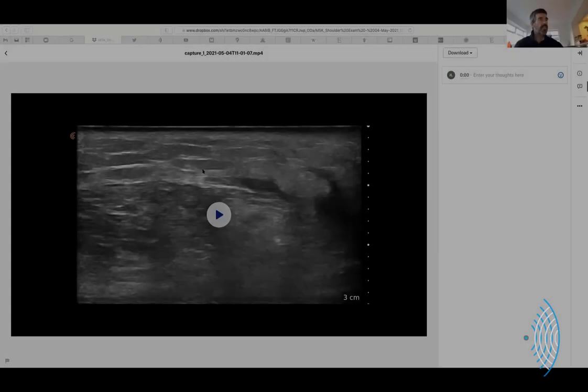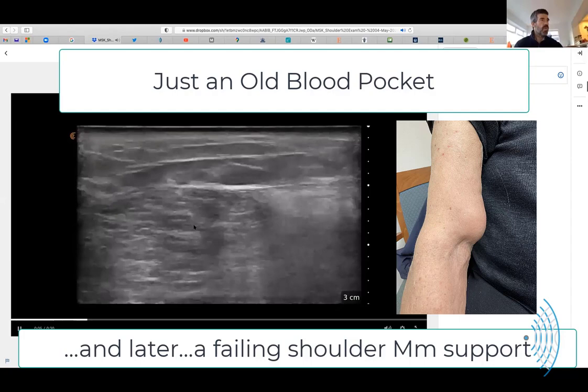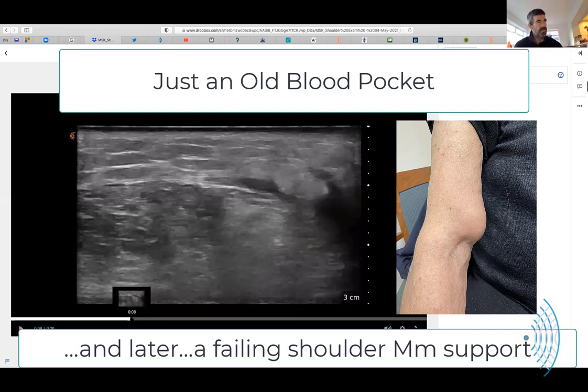Yes, I can see that just fine. So if I just roll these, I haven't looked at them for a couple of days, so I'm not exactly sure where the salient bits are. But yeah, come in the edge there. If I freeze that, we come back a bit there. See the edge there? Yes. It's like a triangle? Yes. So this isn't encapsulated.